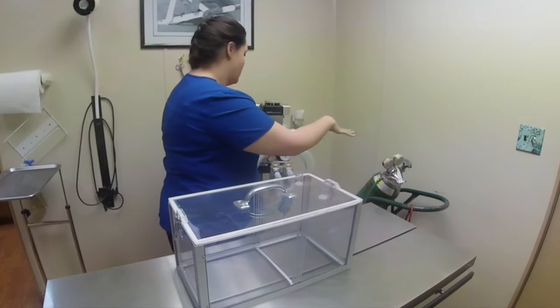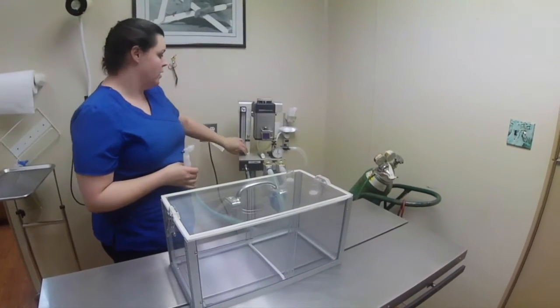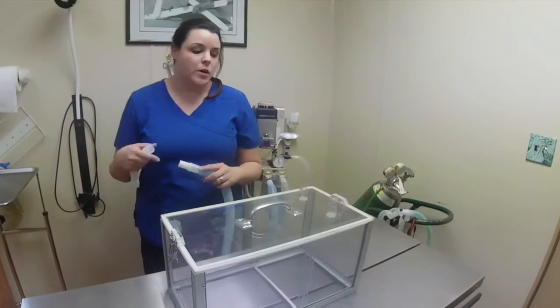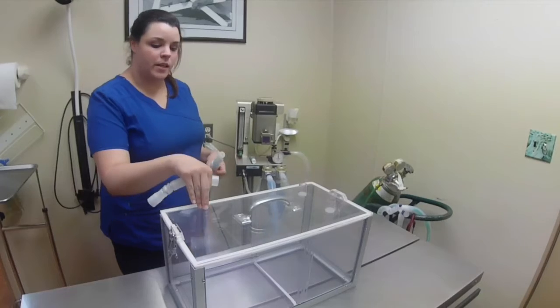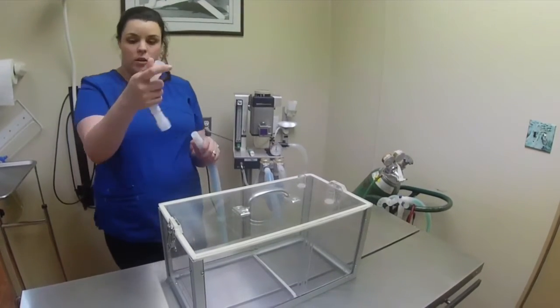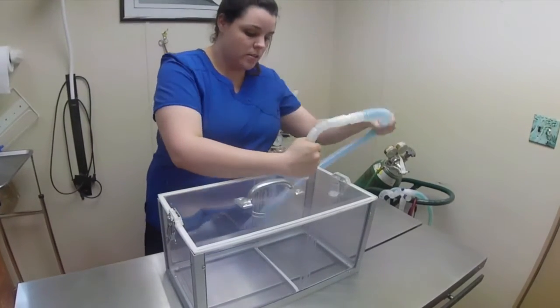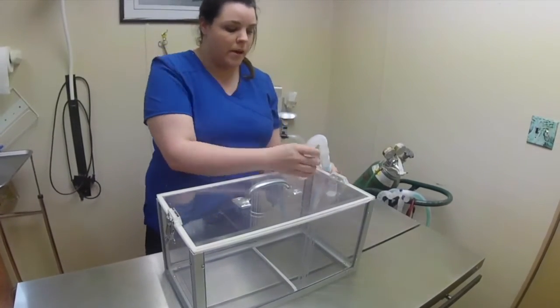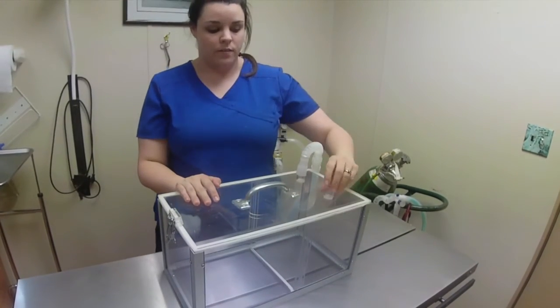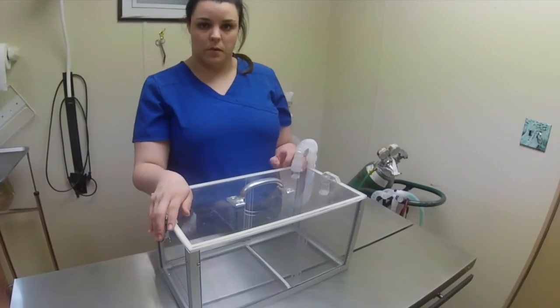You will turn on your oxygen, your isoflurane. You'll make sure that your flow meter is up. Okay, so how to hook up the induction chamber. You're going to make sure that your hoses are good and tight. You'll add this little adapter piece and you will hook it on to either one of these. That way the gas and the oxygen flow in and then it can flow out. And that is how you use an induction chamber.